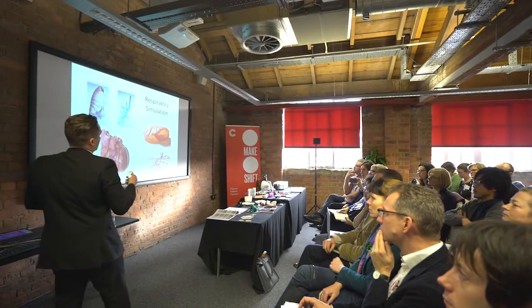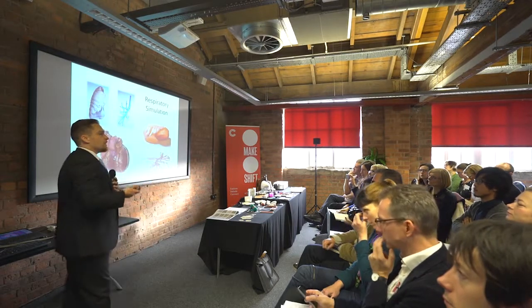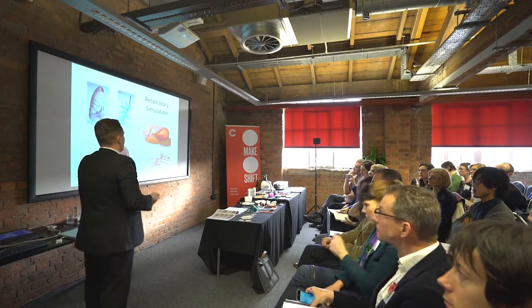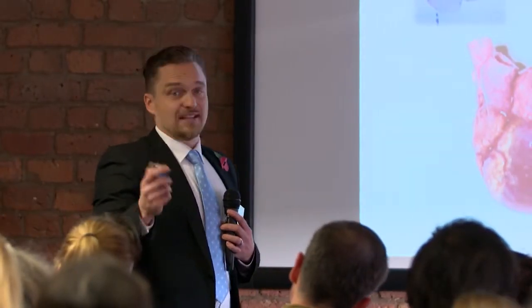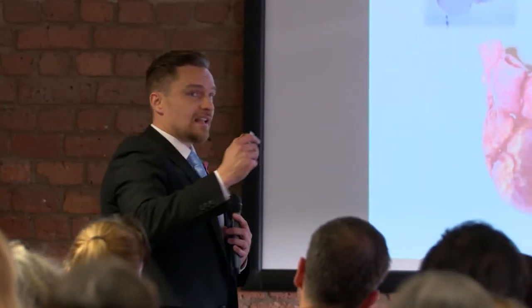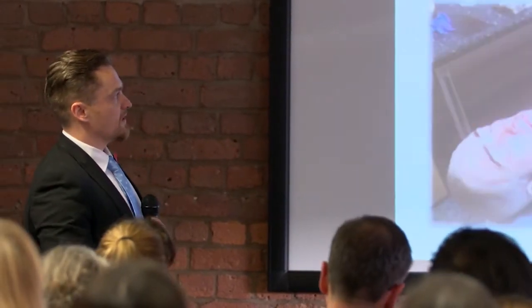So this is kind of where we're at the minute. We're simulating the thoracic cavity, so we've got heart, lungs, the vascular system, even some of the airways, with an overall view, really, of making these things affordable. We have to limit the fidelity. So maximum fidelity, minimum technology. There's nothing plugging into it, there's no wires, there's no sensors.